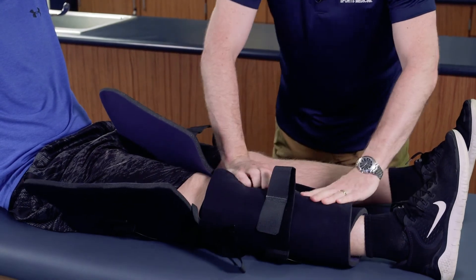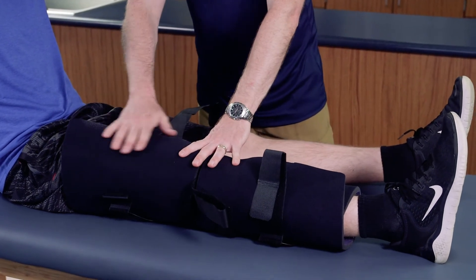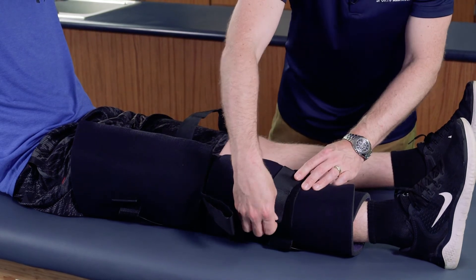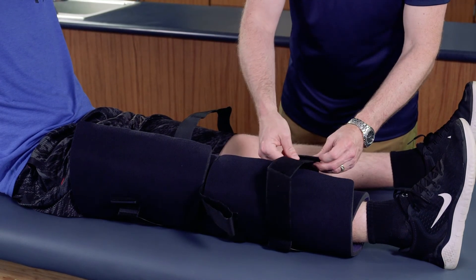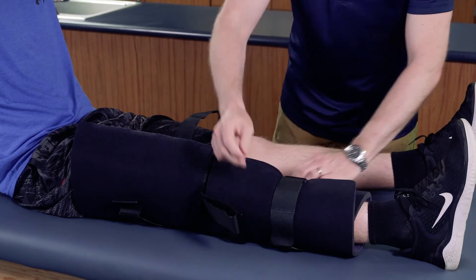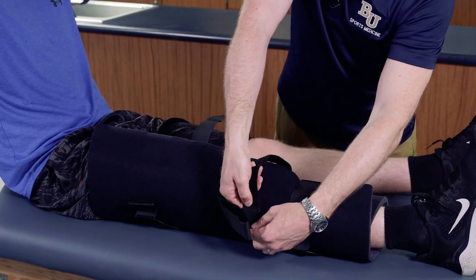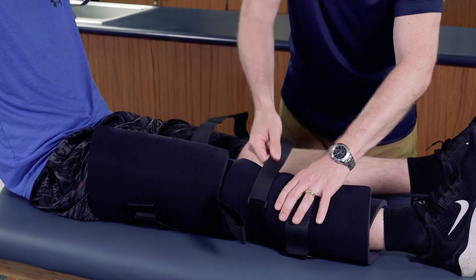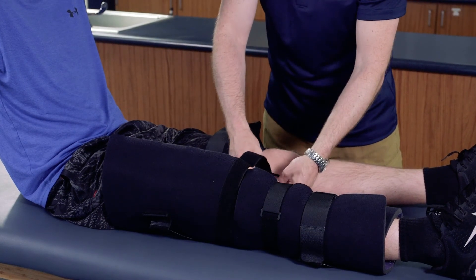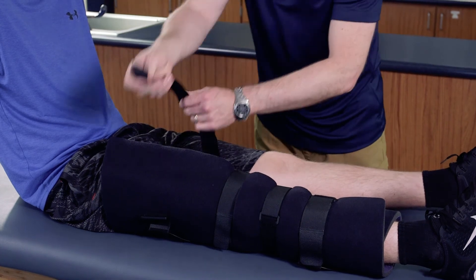We're going to fully secure the protective padding so it's comfortable for the injured athlete. Then we're going to secure the straps, making sure they're nice and secure — not too tight to cut off or disrupt circulation, but enough so the brace is snug, doesn't move around, and keeps the knee in an immobilized position.